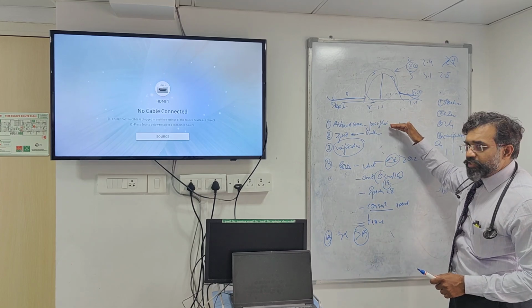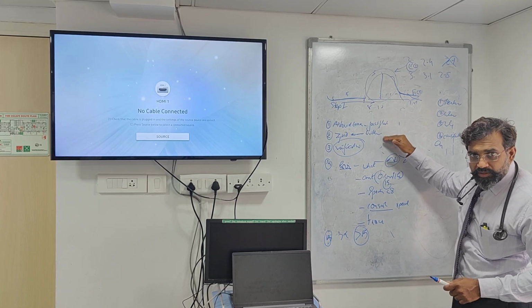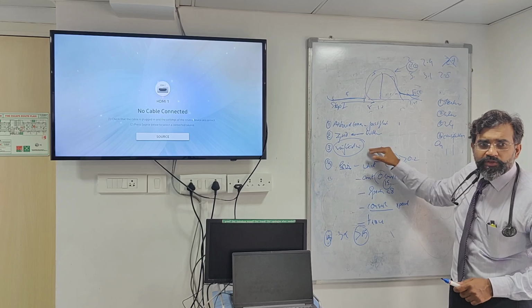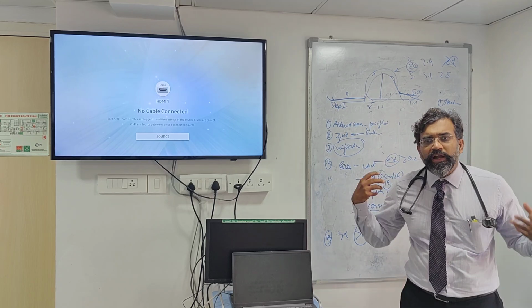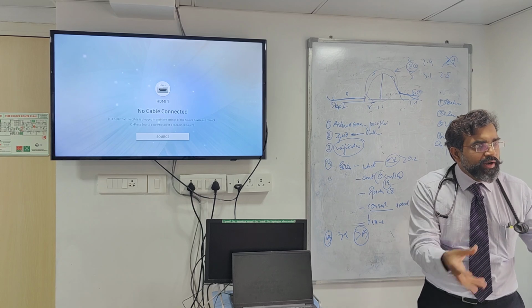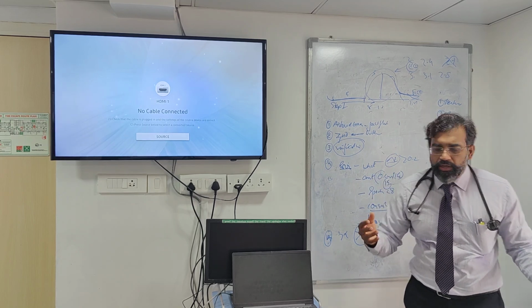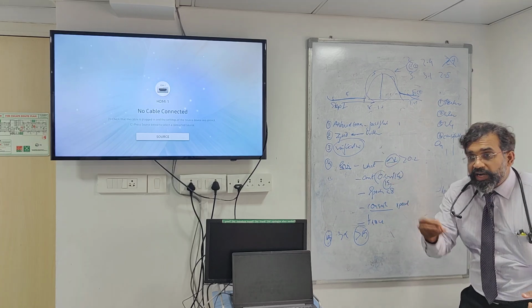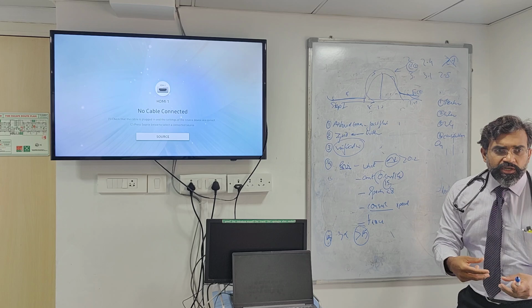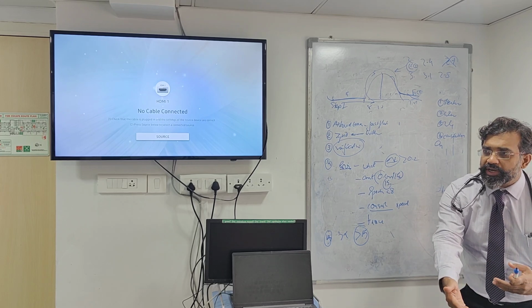The steps start, and you know the importance. You start by checking your arterial trace, of course after entering the demographics. Then you zero level. After zeroing, you verify whether the position is right. Very often these are patients who have multiple lines and multiple devices, noradrenaline, adrenaline, vasopressin all going, and someone might have used the port because otherwise it's not being used. Sometimes it happens that the line is not running, so someone changes the lumen. Nurses may change the lumen, so you must be certain which lumen people are using.